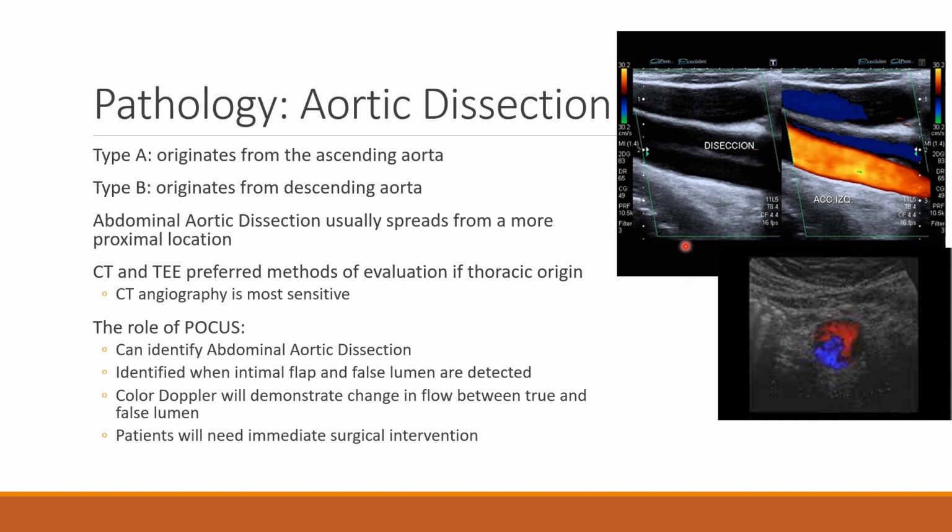So just a few notes about identifying these aortic dissections. As you can see, the tunica intima is a very thin echogenic line here. This could very, very easily be overlooked. So again, I can't stress the importance of practicing that sensitive B mode operation of your equipment, where you're turning that gain all the way up, tapering it off, making sure that your eyes are looking at this and understanding that this is not just an artifact that you're trying to get rid of, but that it is a true pathology. Once you've seen that, you can prove it to yourself by adding color.